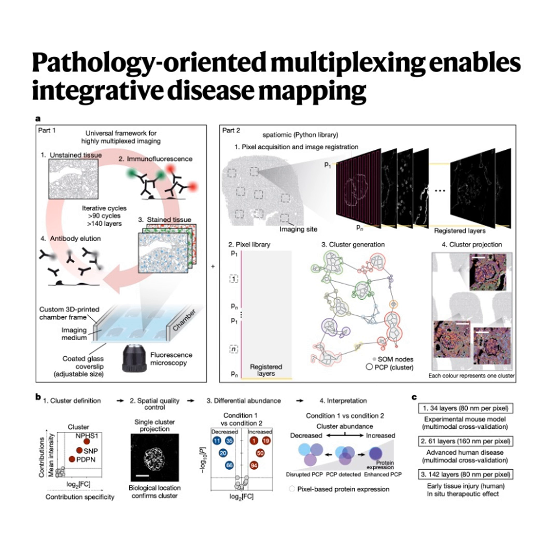Even the fancy multiplexing tools we have now, things like IMC or Codex, are great for telling you what cell it is, but they often top out at maybe 30, 40 markers. And the resolution averages around 267 nanometers. Good for identifying the cell type, but not quite sharp enough to see that detailed molecular dance happening within the nucleus or mitochondria. Right, you miss the critical subcellular details.